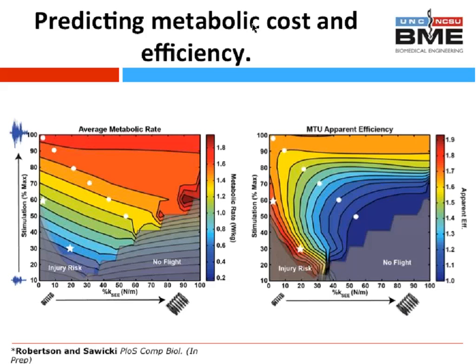It's also slightly less complicated in terms of the fact that it's uniarticular, so it's less affected by anything that might be changing at the knee, which is good. I should also note it is slightly harder in terms of the ultrasound imaging though to really get good images of soleus. So in that sense at least, the gastrocnemius would be an easier option.